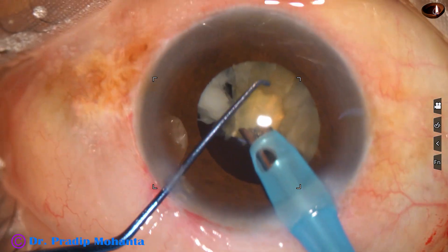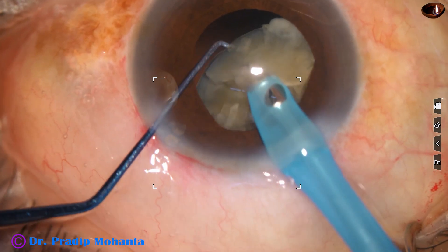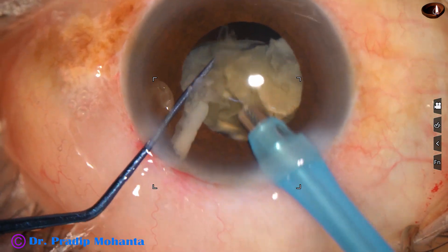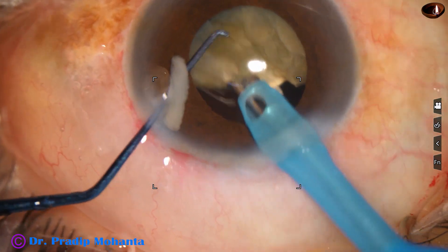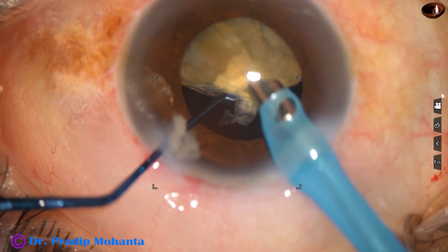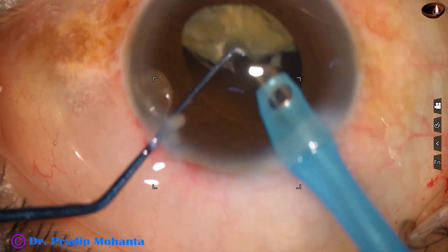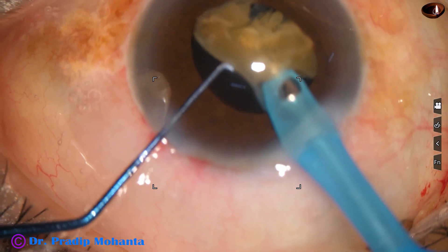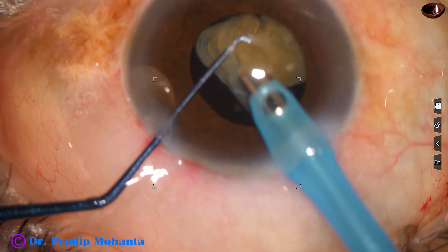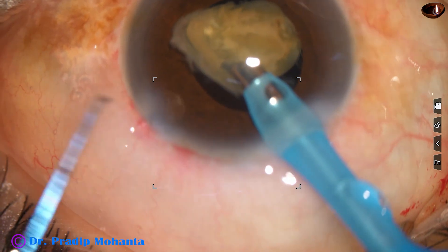Now see the posterior capsule. There is no epinucleus, no cortex to protect the posterior capsule. In such cases, it is always better to use the IOL scaffold technique for emulsification of the last nuclear piece. So here I decide to come out — I just try to emulsify this first. After emulsifying almost half of this, I decide to come out and use the IOL scaffold technique.